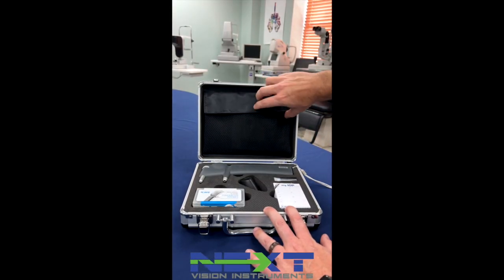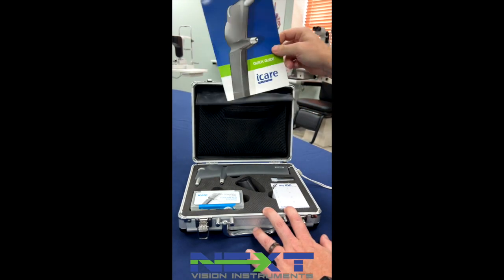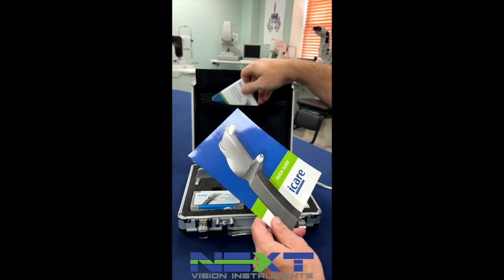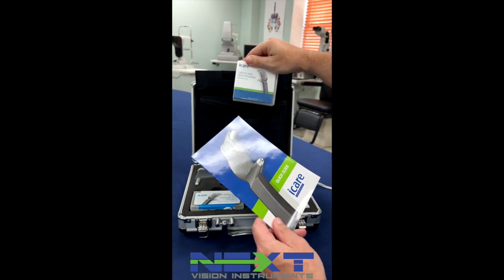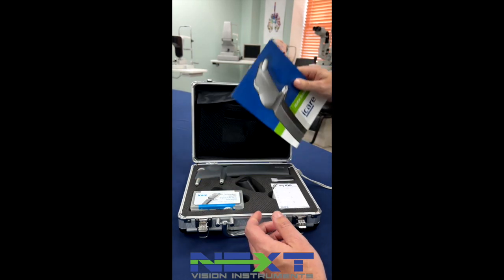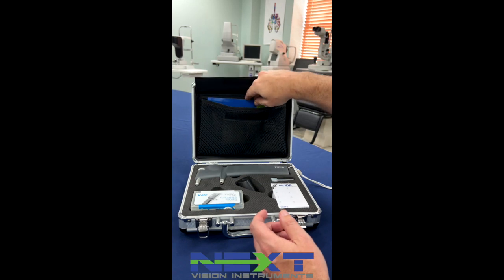In the top of the pack here of the case, it gives you a little quick guide. There's a USB with the user's manual and maintenance. You can look at that to tell you different features of the eye care.